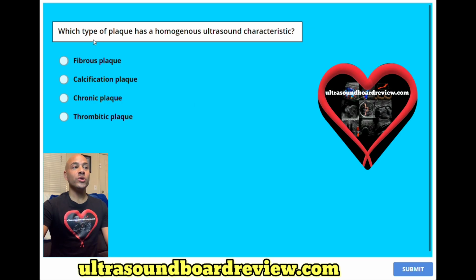Question 99. Which type of plaque has a homogeneous ultrasound characteristic? A, fibrous plaque. B, calcification plaque. C, chronic plaque.